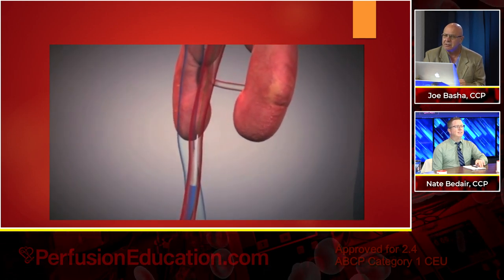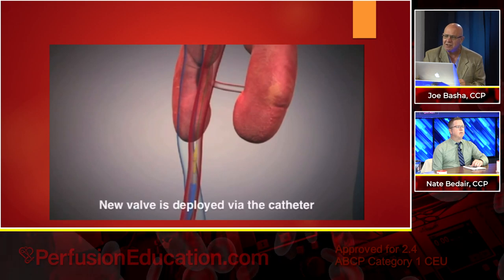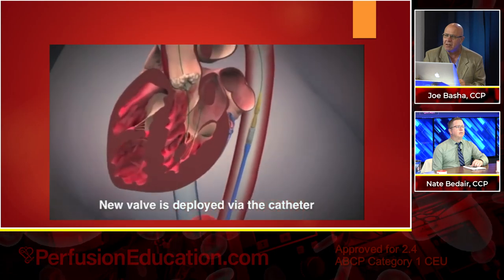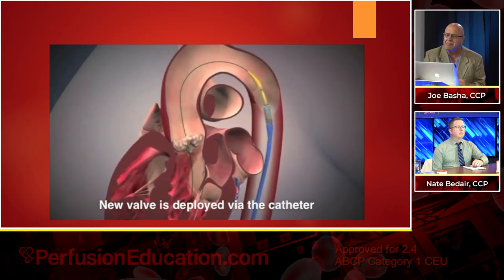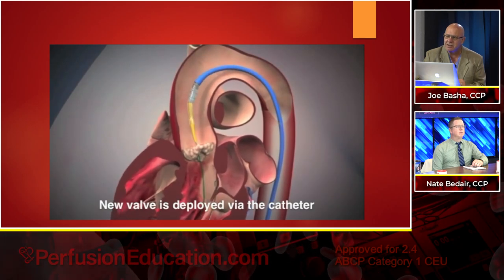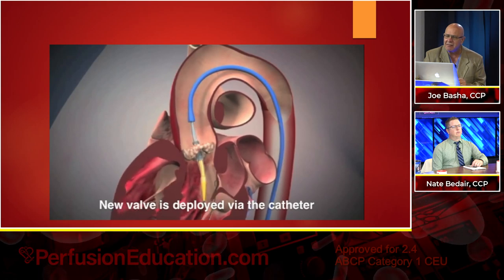Well, let's watch. Look, here comes the valve. It's going to come up. They're going to change it over. Look at how perfect that is. Look at that beautiful aorta. Look at how it's right smack in the middle. Goes around so perfectly. Goes into place. New valve is deployed.